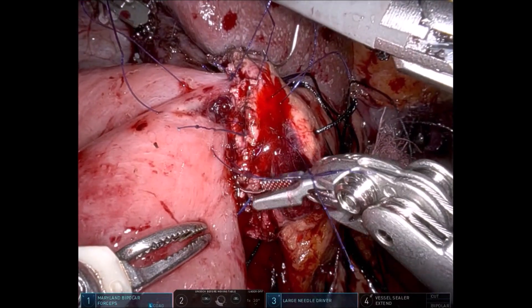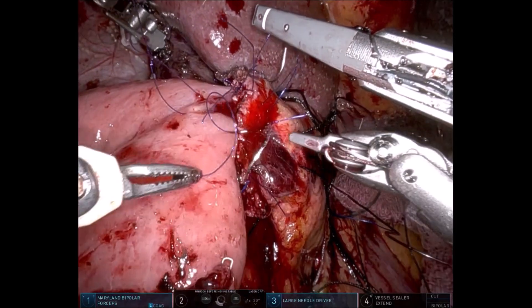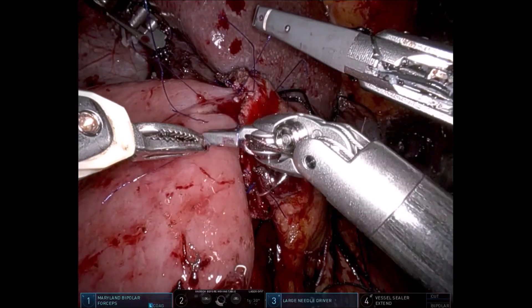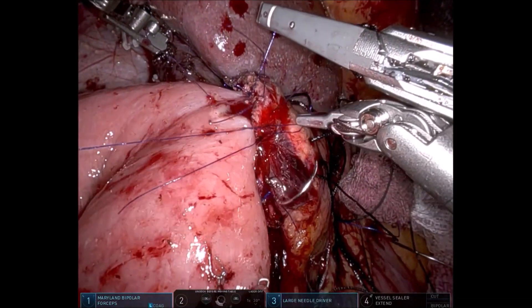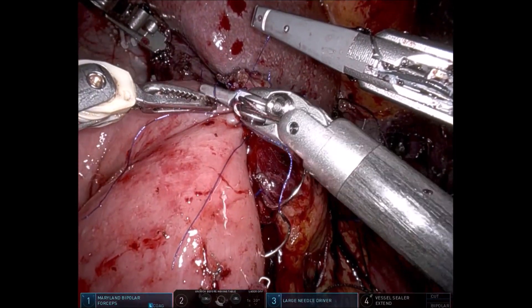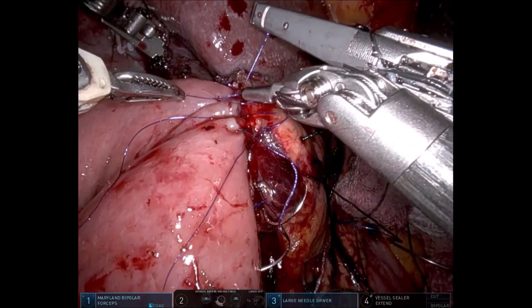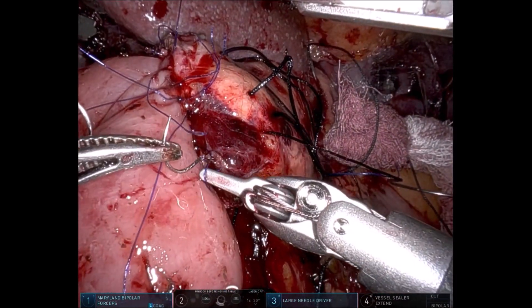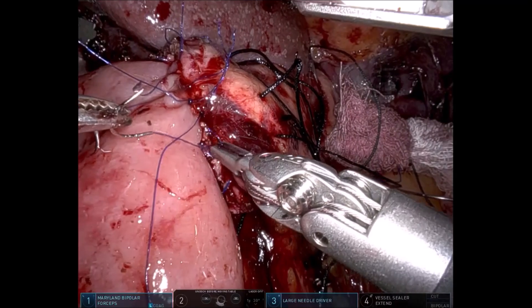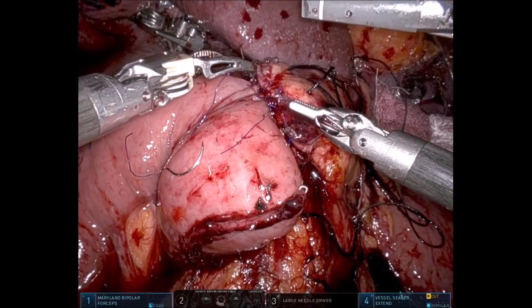Now all sutures are tied. We have kept many sutures as stay, which would have caused great confusion in laparoscopic surgery. Since this is robotic surgery, although the field view shows 4-times magnification, at the console we see 10-times enlarged vision, and just 10 to 12 cm of suture length is sufficient to place very good throws. The wrist movement of the robotic needle holder enables us to take bites very precisely and completely avoid any confusion.